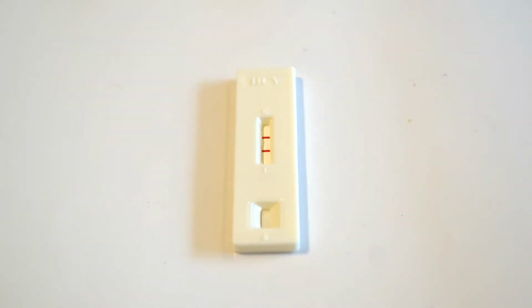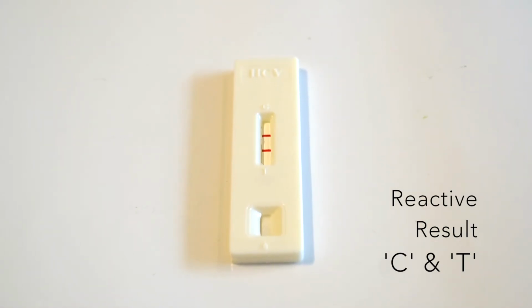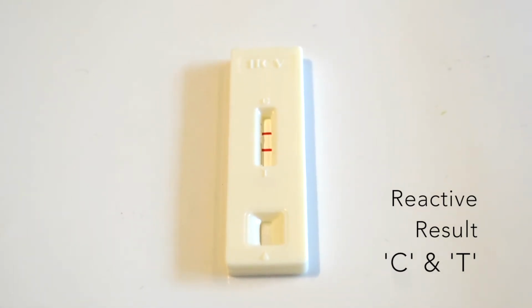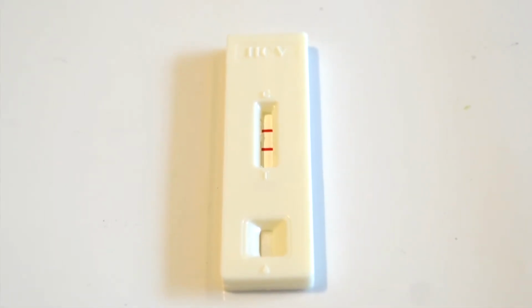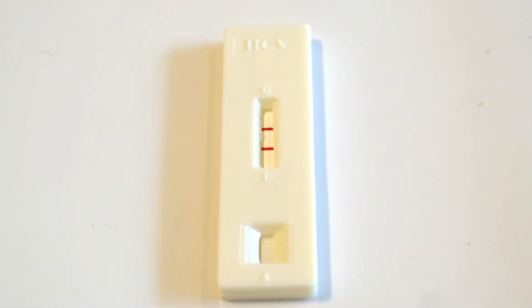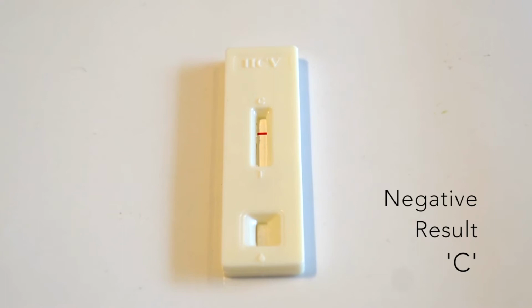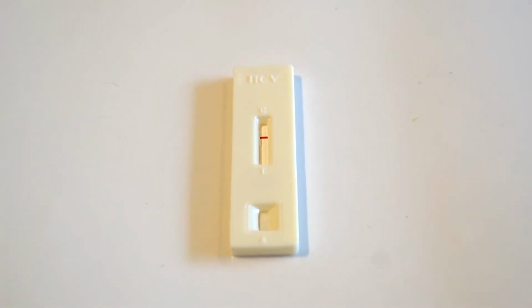In the event of a reactive result to the test, this will be shown by both a line in the control area and a line in the test area on the test cassette. These lines will appear next to the letters C and T. The shade or color of the test lines may vary, but the result should be considered reactive even if one of the lines is faint or a slightly different color. If the test result is negative, this will be shown by a control line only.